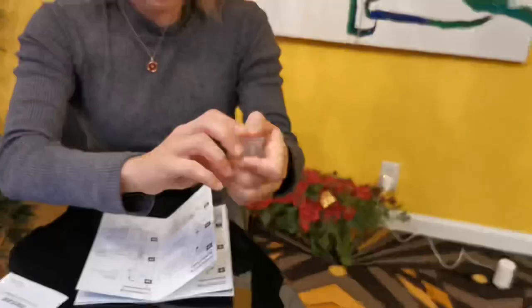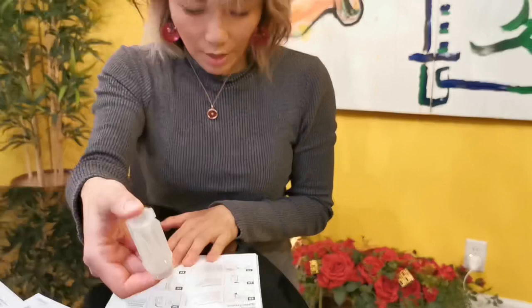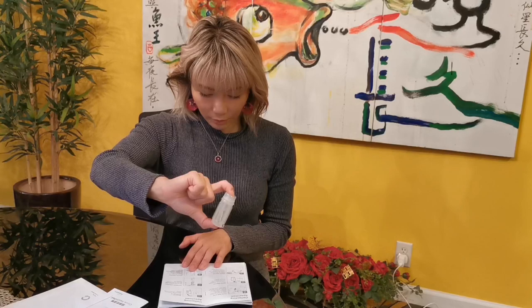So now, shake it 5 times. 1, 2, 3, 4, 5.